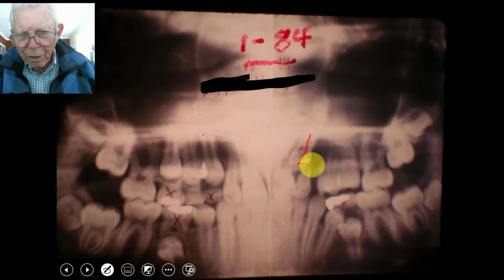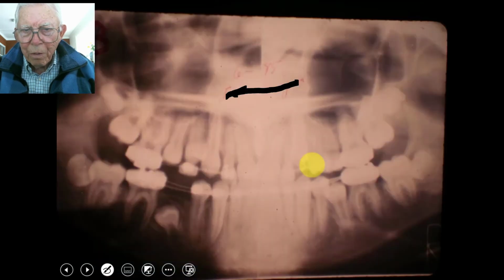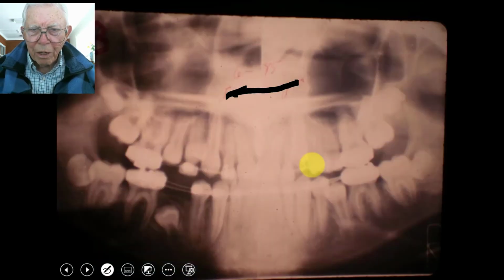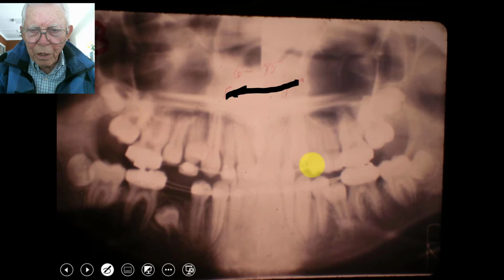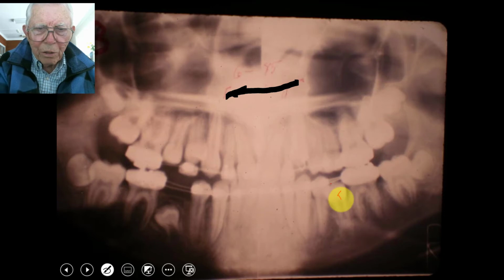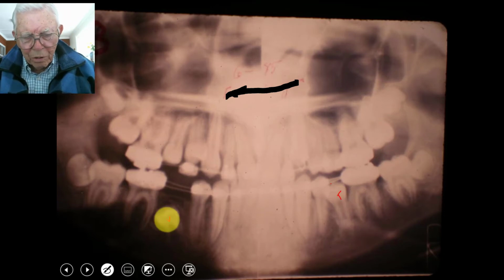I don't have any in between pictures of it there, but when you do this, well, it's still there. And now that X-ray shows the cuspid is over, coming in this space. So we're going to enlarge that. This tooth is coming up. So now we'll come in and take these bicuspids out on the case.